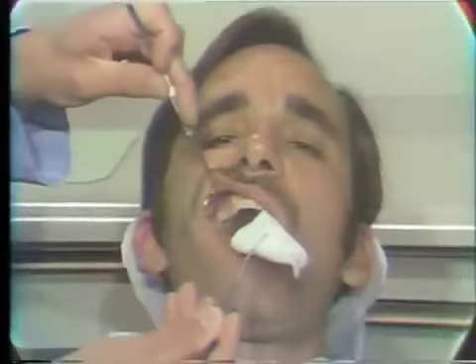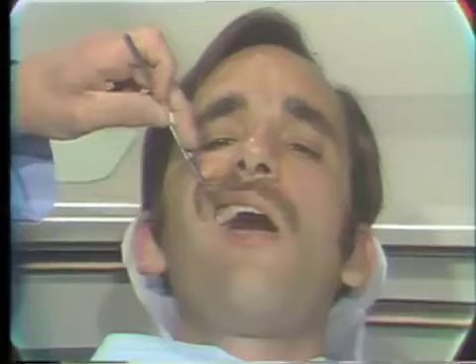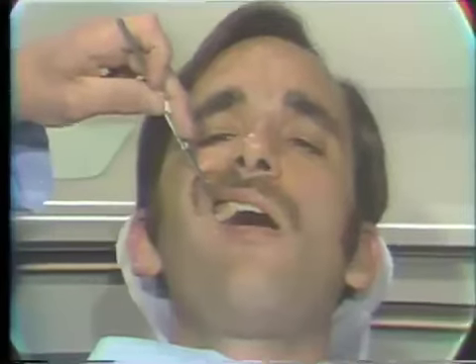As we are simulating here, next the area is painted with an antiseptic solution such as Mercresin, as we have here, to destroy as many of the contaminants in the field as possible. Then with a sterile scalpel, the summit of the abscess is incised and the pus is allowed to come to the surface.